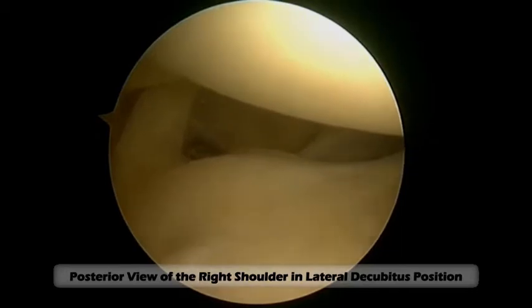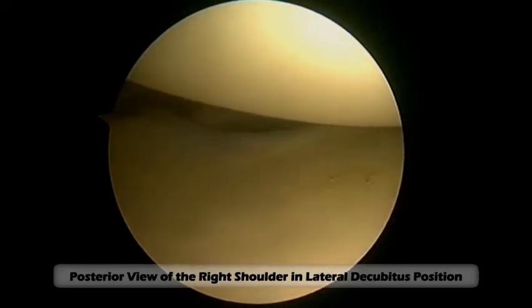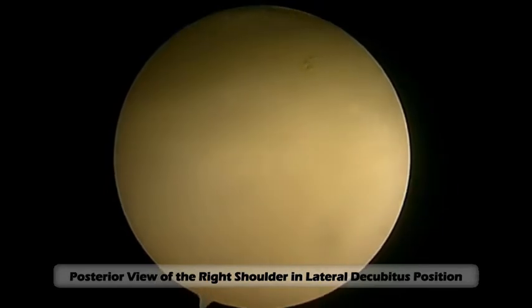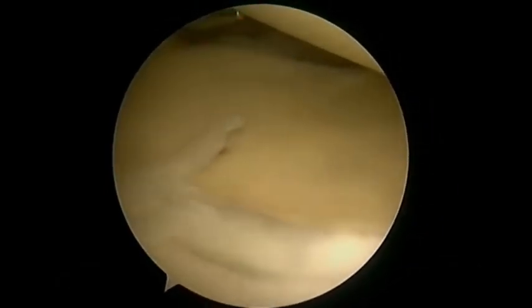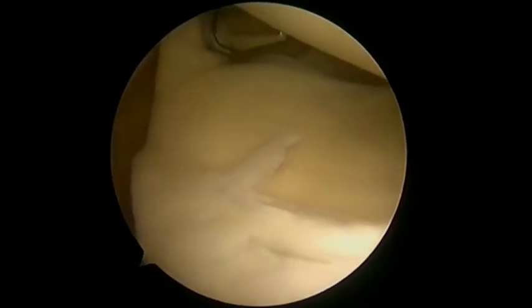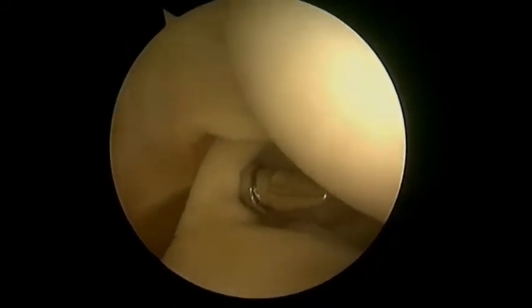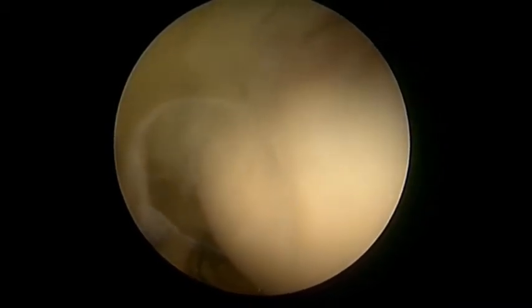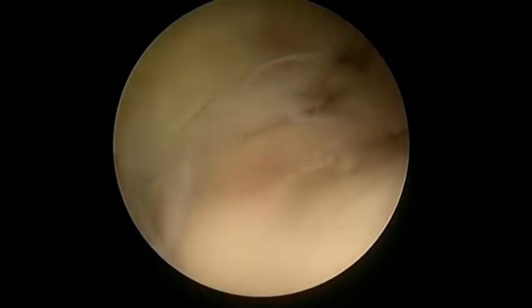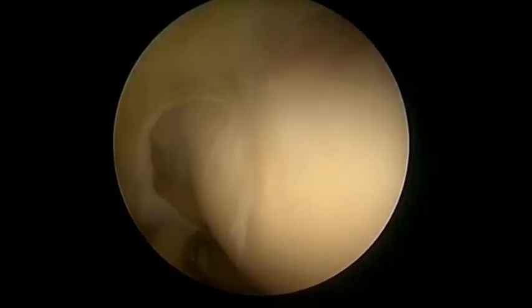Here you visualize a right shoulder of a college throwing athlete in the lateral decubitus position through the posterior portal. It is evident that there is fraying to the posterior labrum inferiorly, which progresses superiorly to displace labral tissue posterior superiorly. It is also evident that there is fraying to the undersurface of the posterior aspect of the supraspinatus and the anterior aspect of the infraspinatus tendon.